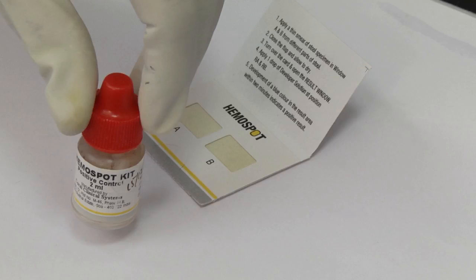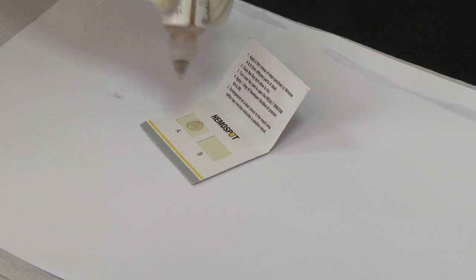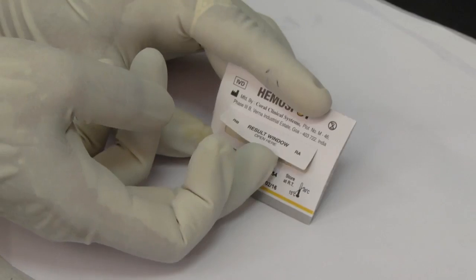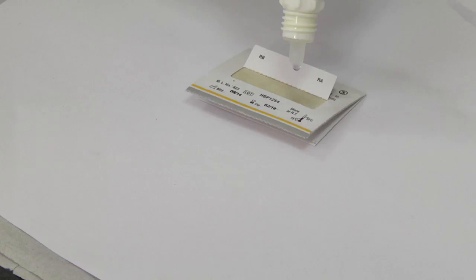Positive control available with the kit should be run along with the test samples to assess the efficacy of test cards. The positive control is run exactly like a test sample.